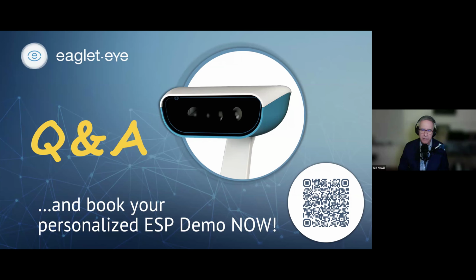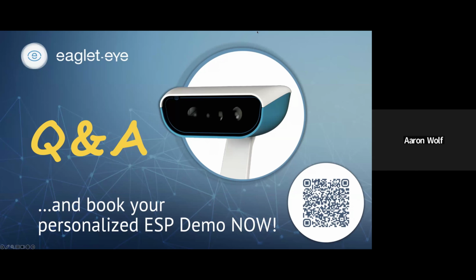Okay, so somebody else is asking, does the eaglet assess anterior posterior cornea for early keratoconus diagnosis as well, or just for the fit? The eaglet does have a KPI, which stands for keratoconus predictive index.